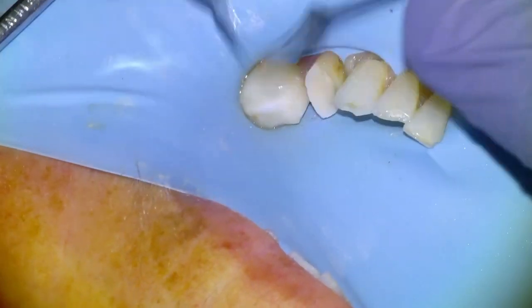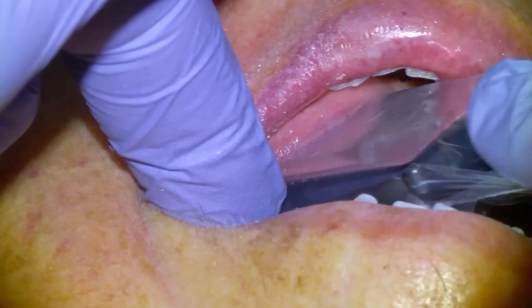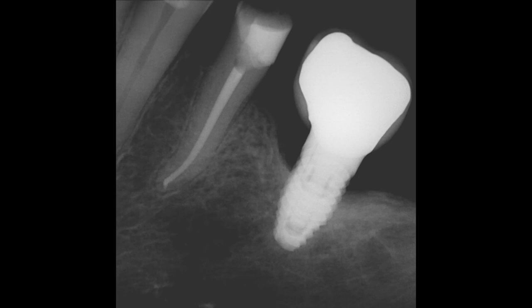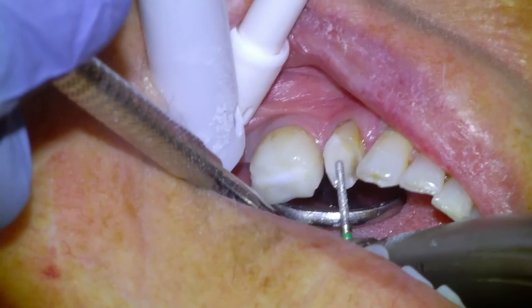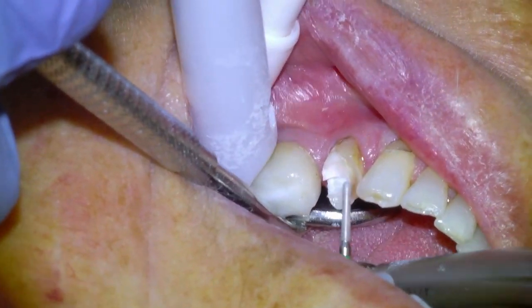We'll remove the band and the rubber dam and then we'll get a post-op PA — I'll usually just hold the x-ray and have Jackie expose it. We're happy with the endo, but this is a palliative implant. We talked about options including preemptively explanting and placing bone graft, but the patient just wanted to keep it — water pick every day, try to keep it for as long as possible, and once it gets mobile then remove it and discuss options at that point.